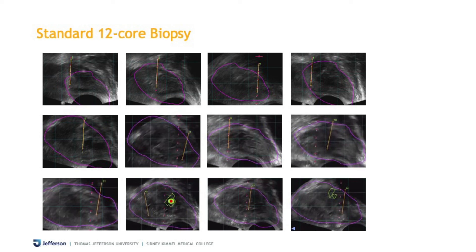Those were the targeted biopsies, and now I will turn back into the sagittal view where I typically do my systematic 12-core biopsy. We do a systematic 12-core biopsy in addition to the targeted biopsies for every patient.